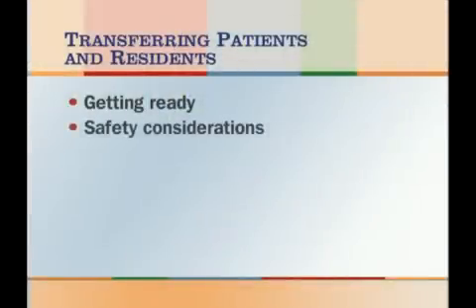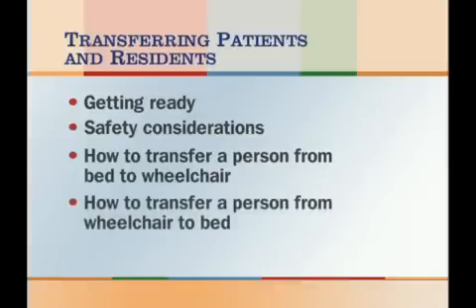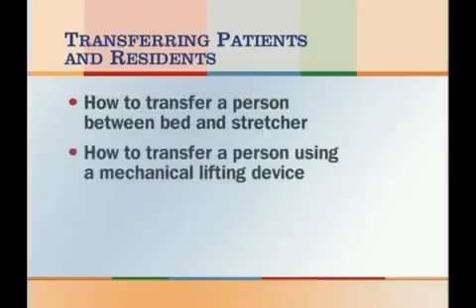In this video, our subject is transferring patients and residents. We will discuss getting ready, safety considerations, how to transfer a person from bed to wheelchair, how to transfer a person from wheelchair to bed, how to transfer a person between bed and stretcher, how to transfer a person using a mechanical lifting device, and finishing up.